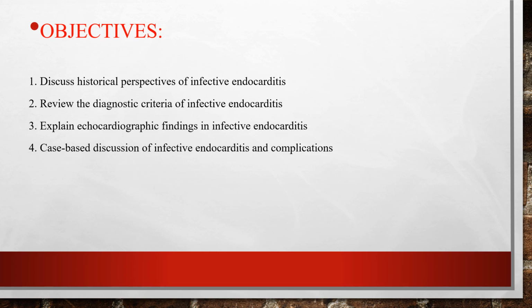The objectives of my talk are first to discuss the historical perspective of infective endocarditis, review the diagnostic criteria of infective endocarditis, and explain the echocardiographic findings in infective endocarditis, and then we'll have a case-based discussion of infective endocarditis and complications.